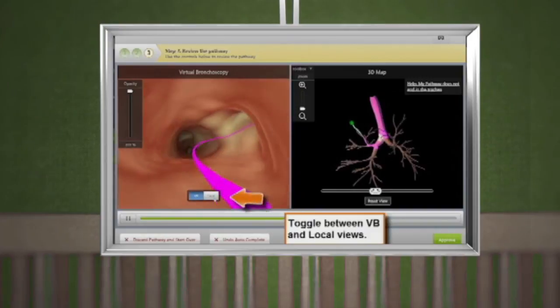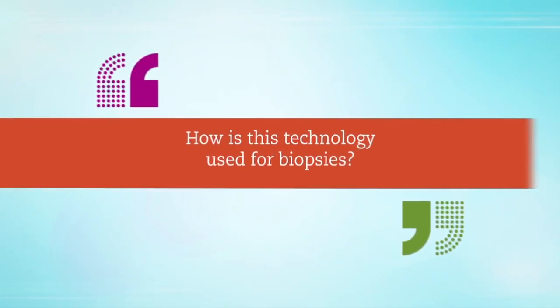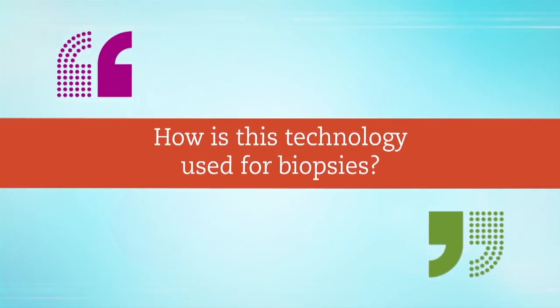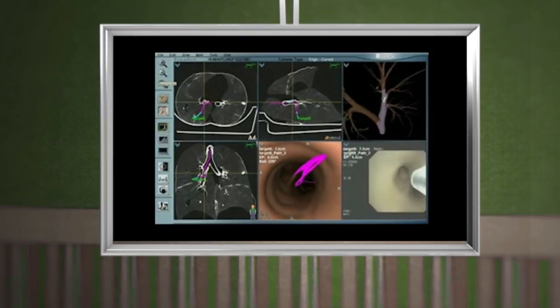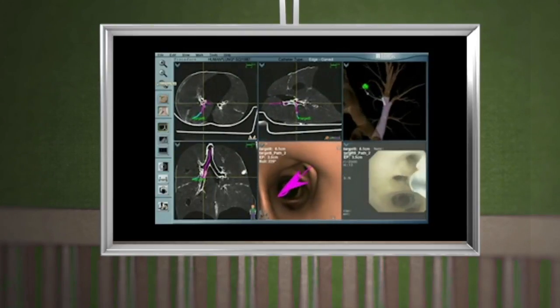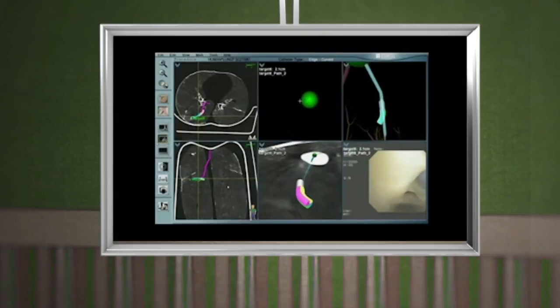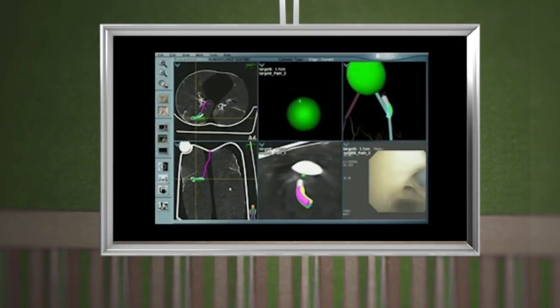Utilizing a computer system that forms a sort of GPS over the chest and combines that GPS system with a CAT scan of the patient's own anatomy, we can then use a steerable catheter to drive out to any lesion anywhere in the lung. Abnormal lesions in the lung that require biopsy can be highlighted as a green dot, and there's a pathway delineated by the computer to guide the physician as to how to get to that lesion in the most effective and safe manner.